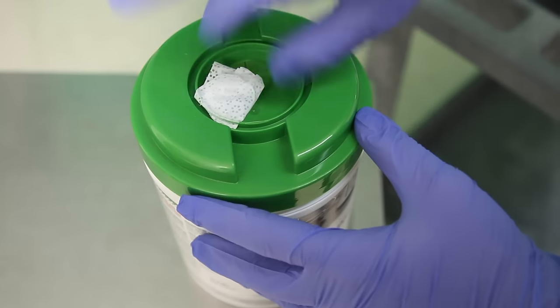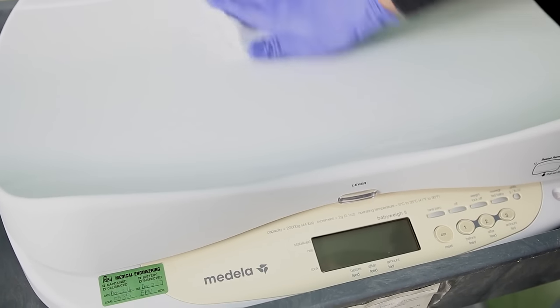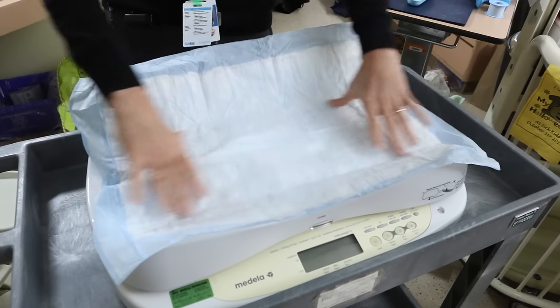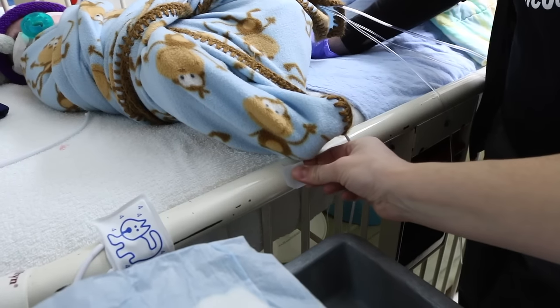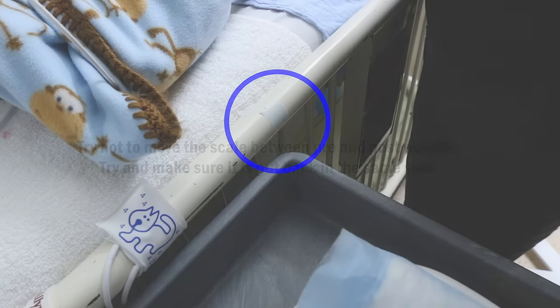The first step is preparing for the weight. Wipe down the scale with a Virox wipe to ensure it is clean. Place a blue pad on the scale. Place the scale next to the crib or isolette, but not touching it, and landmark where it is placed with a piece of tape so that you will remember the exact placement for the post weight.